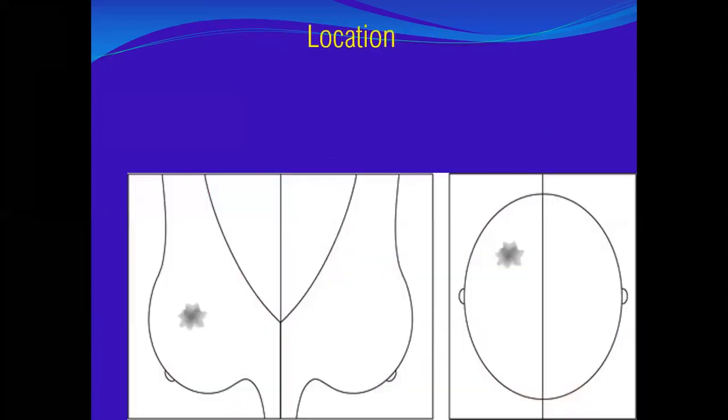Okay, Sarah. Just localize for me this. What is the type of asymmetry in this schematic view? This is a focal asymmetry. Excellent, focal asymmetry. What is the location? Upper outer quadrant. Yes, so the location is by quadrants.